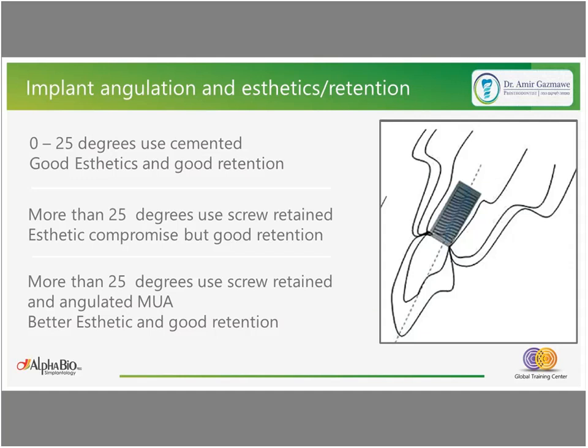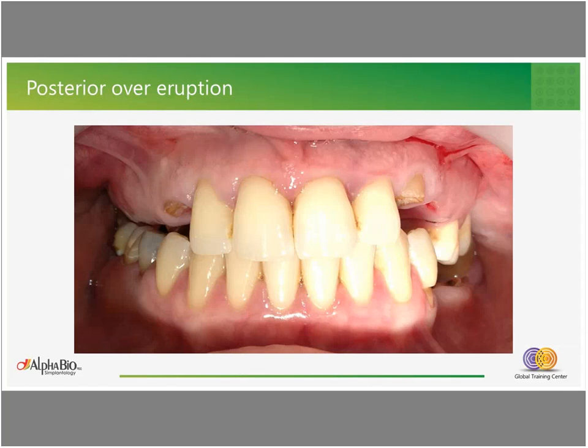This is a clinical case that you can see here. We have a limited space for restoration at the molar area.